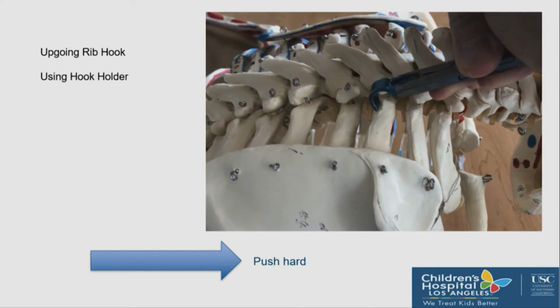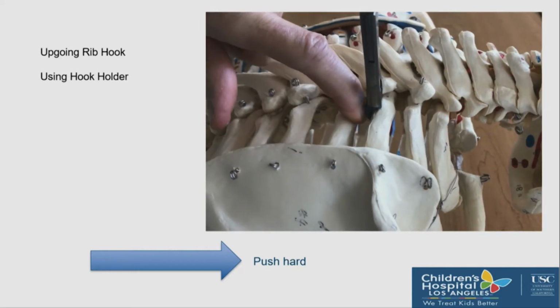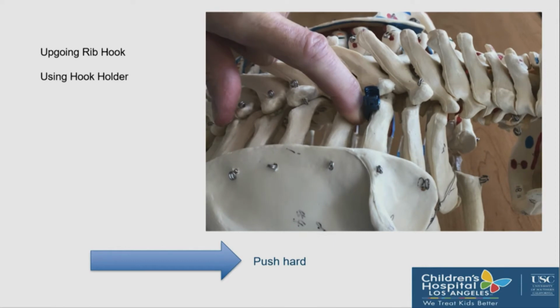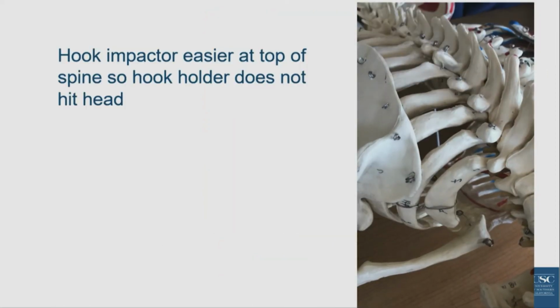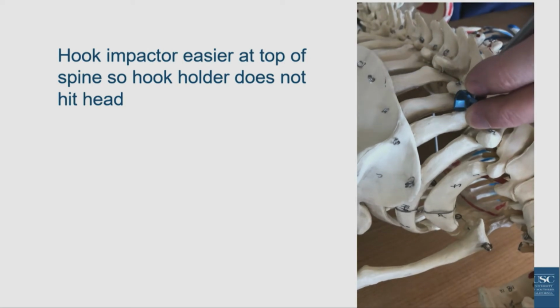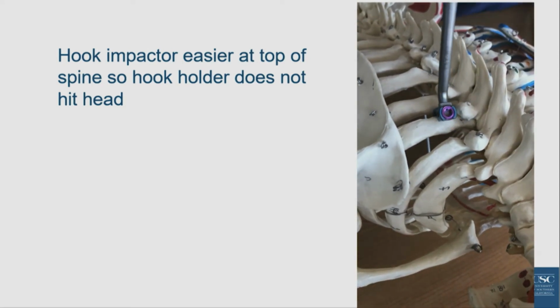You just move with your finger and pop the hook right into place. And then there's enough muscle there that it holds it. I don't really hold my finger there. This skeleton doesn't have too much muscle on it. Now, when you're doing this at the very top, if you use a hook holder, you hit the patient in the head. So here's a hook impactor.